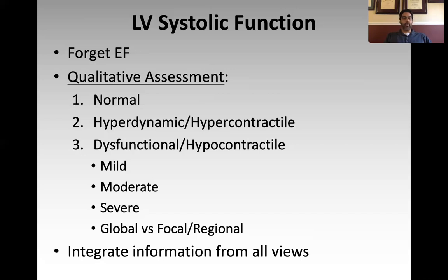So the bridge to being able to get good at EF is a pretty long one. And I don't think any of us as intensivists should really feel that we will be able to cross that bridge, number 1. Number 2, if you think about it, from an intensivist perspective, from an acute care specialist perspective, the EF is really more of a prognostic number than it is a hemodynamic number, okay? We as intensivists are interested in things like flow and hemodynamics. The EF, even though it may be an approximation of those things, is not necessarily a really full assessment of hemodynamic function and flow.